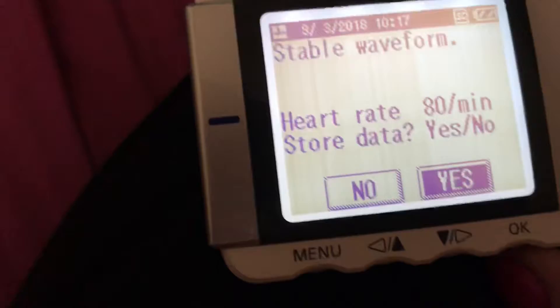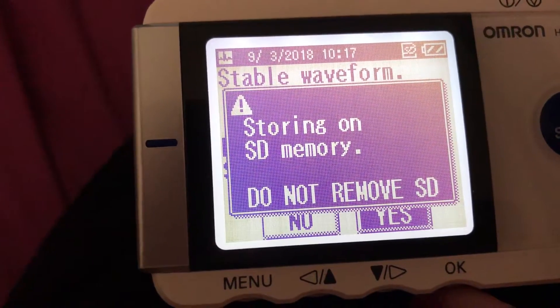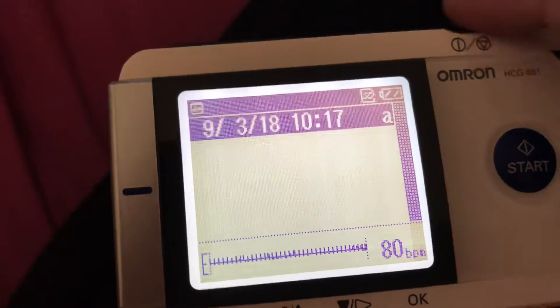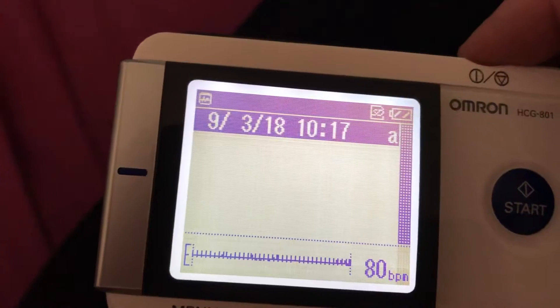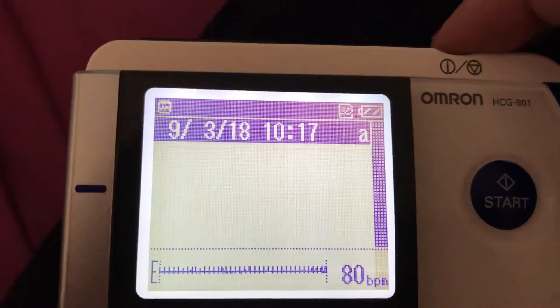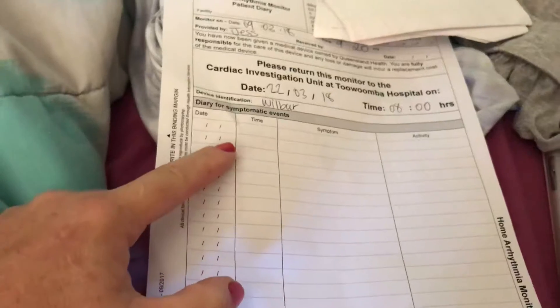I push okay for 'yes, stored,' and then I just turn it off. It's 10:17, so that's been done. Now I just need to grab my pen and write down 10:17.